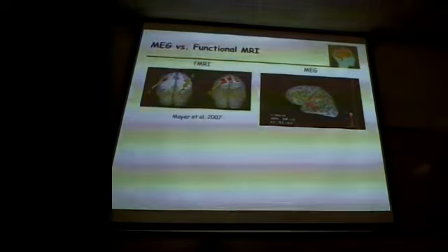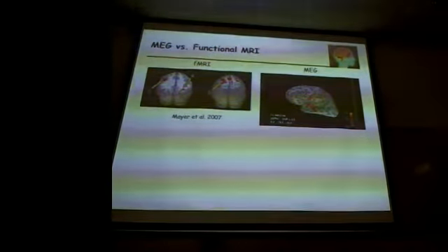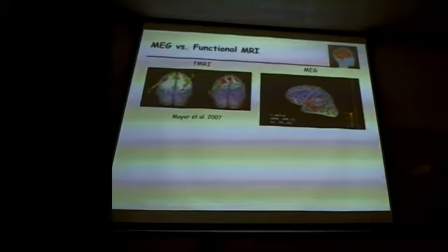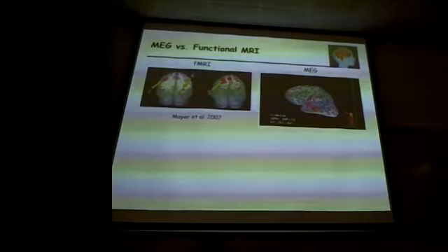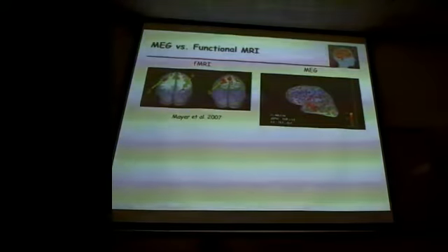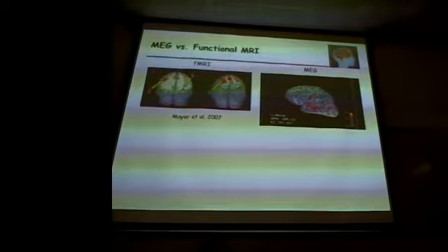The interesting thing is that the background brain activity is actually larger in amplitude than most of these evoked responses. So we take the same approach as fMRI, where we present the stimulus multiple times. This is the averaged evoked response, so we're averaging out the background brain activity, but the background brain activity has a lot going on as it is. That's the previous plot that I showed you, just the time series of background brain activity. That's what the physiological frequency bands are really focused on, the ongoing brain activity. Alpha, for example.